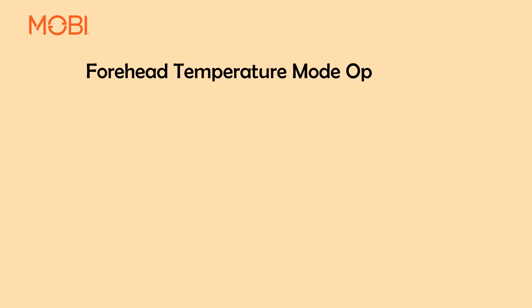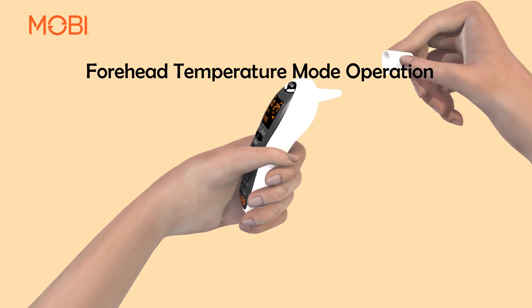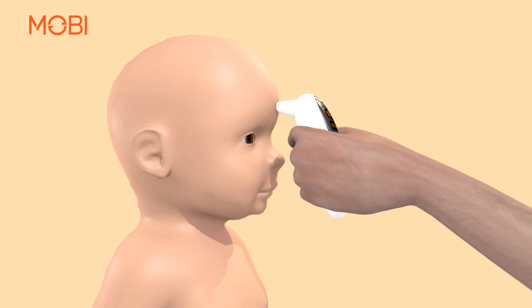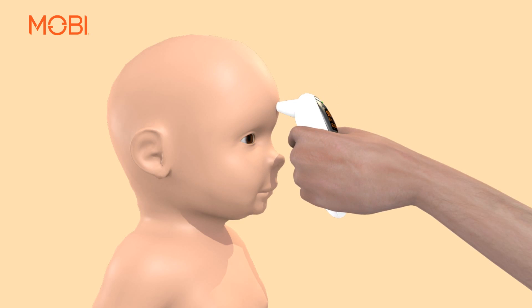Forehead Temperature Mode Operation: Make sure the forehead probe cover is on the unit. Then gently touch the entire tip of the probe to the center of the forehead, midway between the eyebrow and the hairline. Then press the scan button to measure the body temperature.